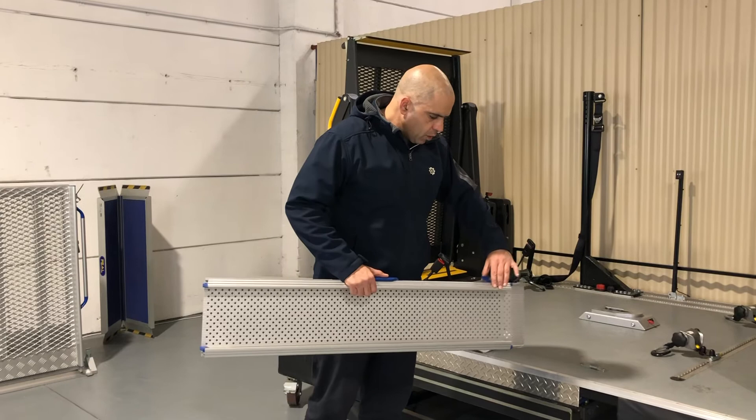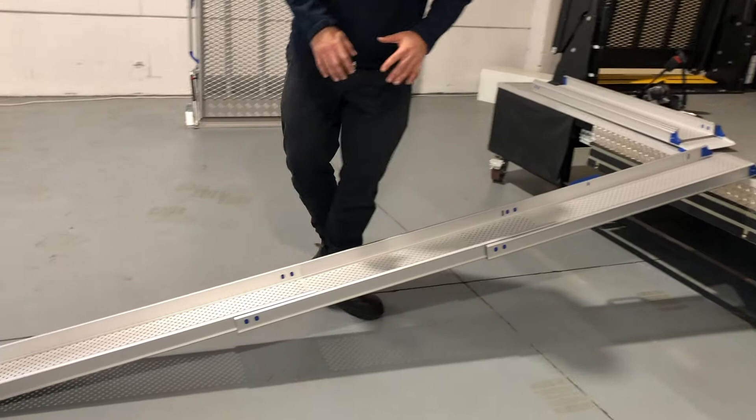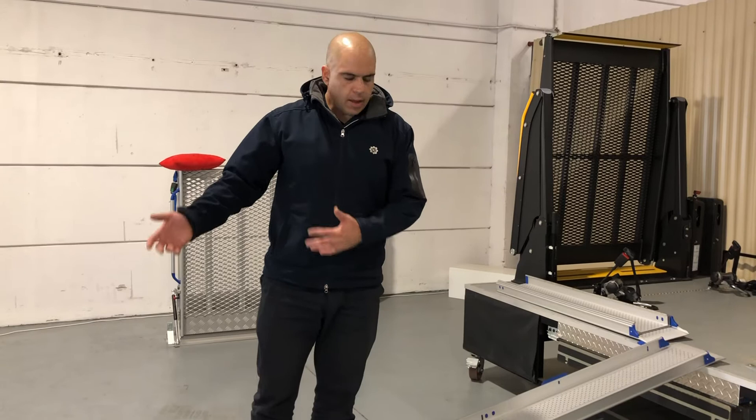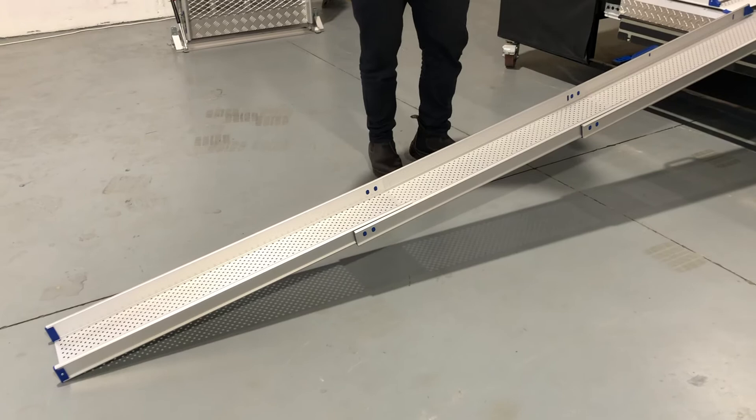Very simply, what we do is we unlock the ramp, pull it all the way out to where we need it to be, and lay it down on the lip of the back of our vehicle. We can adjust the ramp to increase or decrease the angle depending on the user, their strength, their abilities, and what makes them comfortable. We pull it all the way out to its longest variation, which makes it a nice, clean, smooth angled loader.